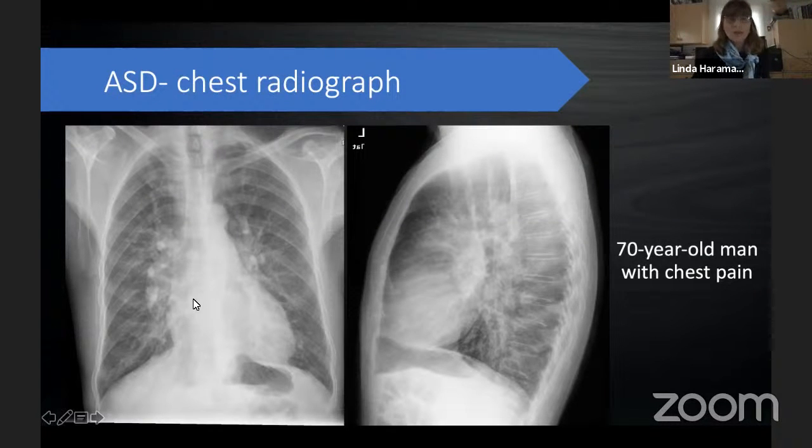So unlike in the case of congestive heart failure, where you see redistribution of flow, a lot of it is the venous congestion, and we see interstitial edema manifest as perihilar haziness. We frequently see pleural effusions. When we have the overcirculation or shunt vascularity related to a left to right shunt, this is the characteristic appearance. Prominence of the central and peripheral pulmonary arteries, very, very sharp. And this is characteristic shunt vascularity. And it's surprising, but it's true that on a semi-regular basis, we have the opportunity to make that diagnosis in radiology or to not make the diagnosis.